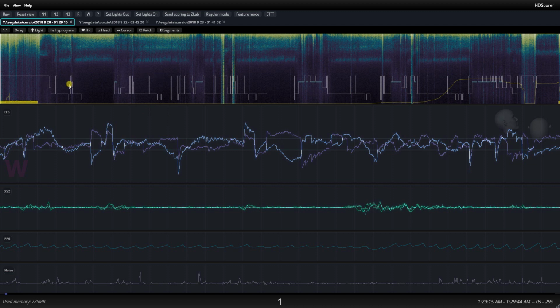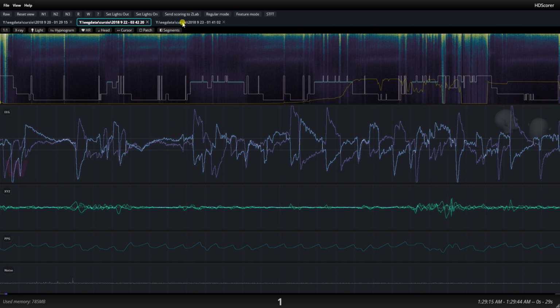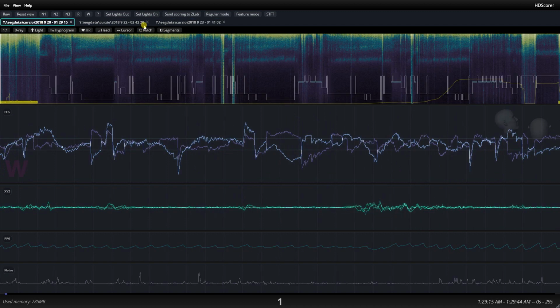But I haven't really looked at these scorings in detail before, so this is a true snapshot of how the algorithm currently functions. There's a lot to say about how it's working, so slowly as I make my way through, I hope to remember all the relevant information.